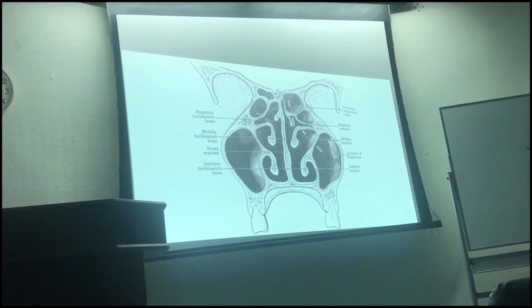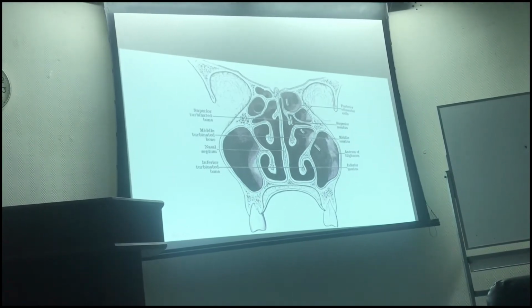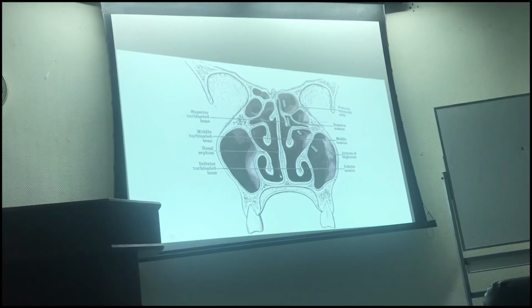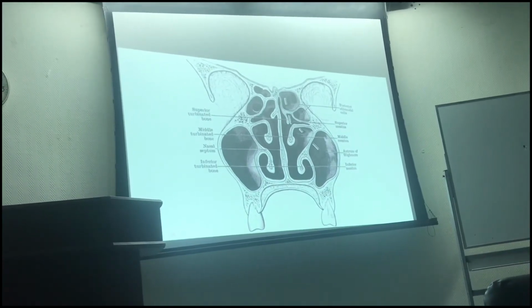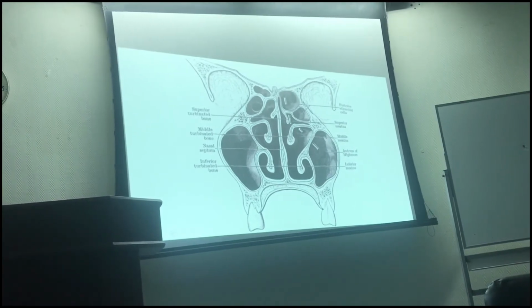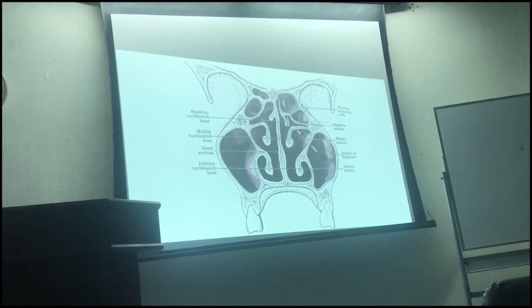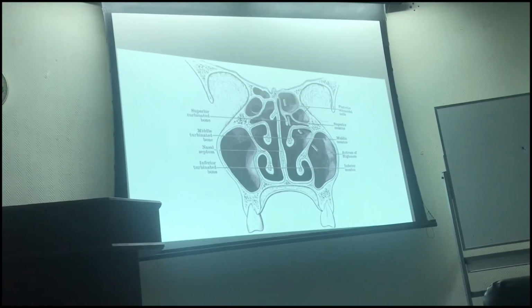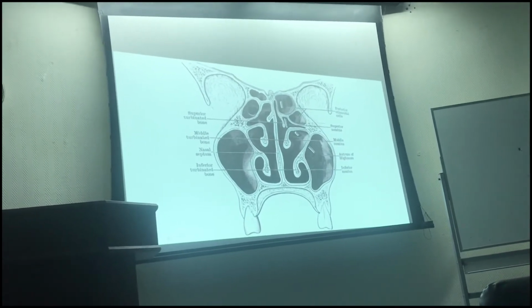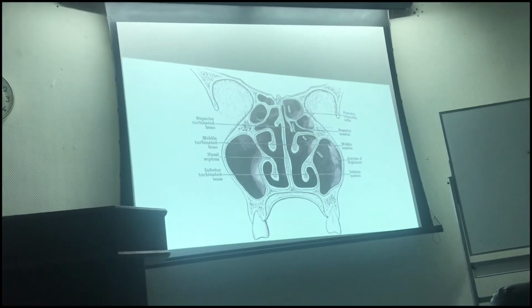You go and try the left, because most people have a deviated nasal septum or enlarged turbinates. These three shelves you see, 1, 2, and 3, are called the turbinates. They are composed of bone and covered by mucosa, and they have an opening below each, which is called the meatus. So we have three turbinates, inferior, middle, and superior, in both nasal cavities.